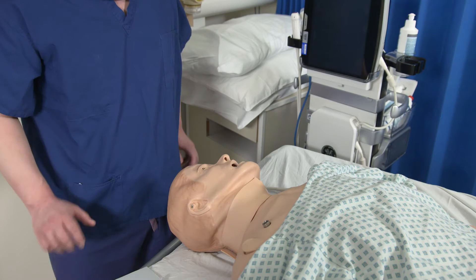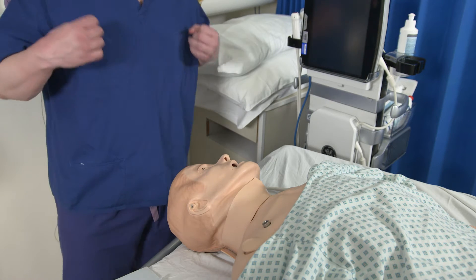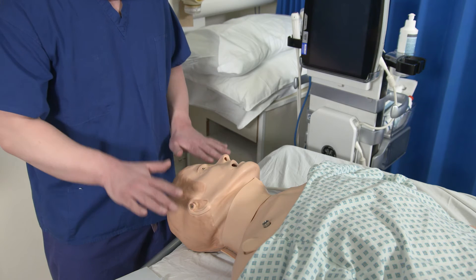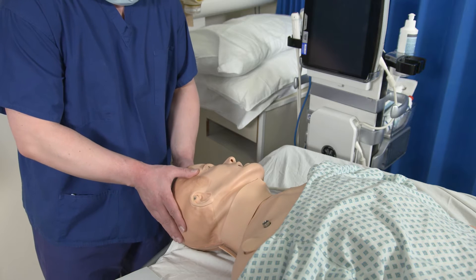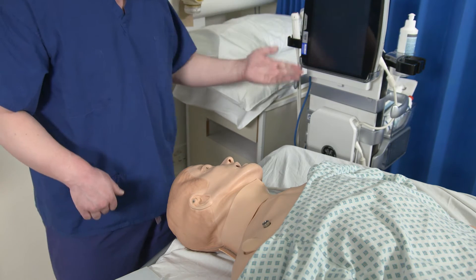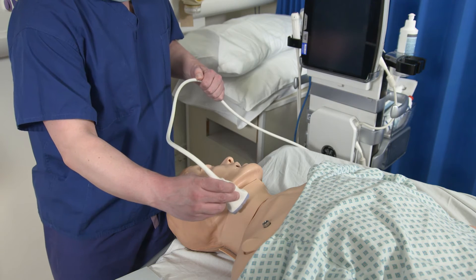We're now going to demonstrate right-sided internal jugular CVC insertion. In order to do this procedure, I would position my patient lying completely flat if possible and with their head turned all the way as far as it will go to the left. I would have my ultrasound on my left hand side so that I could use my probe on the neck here.